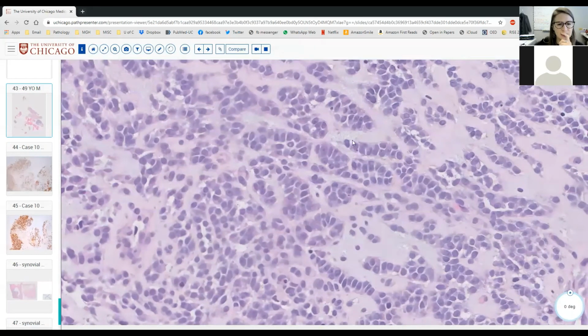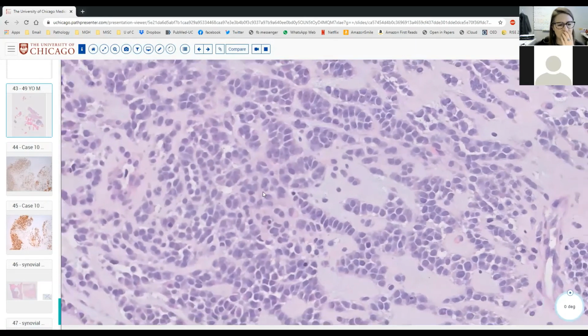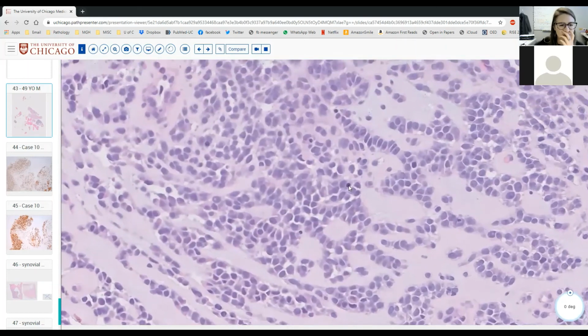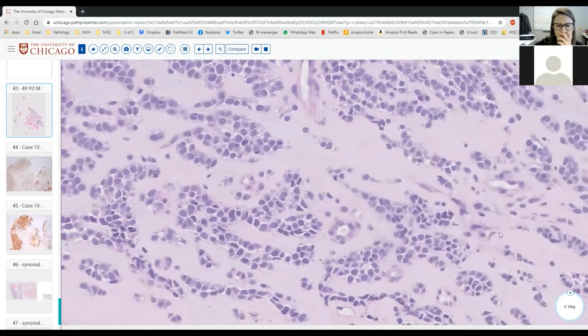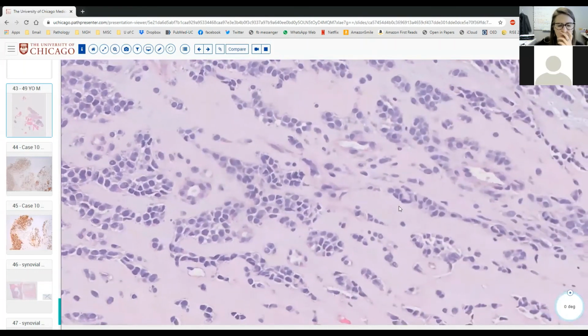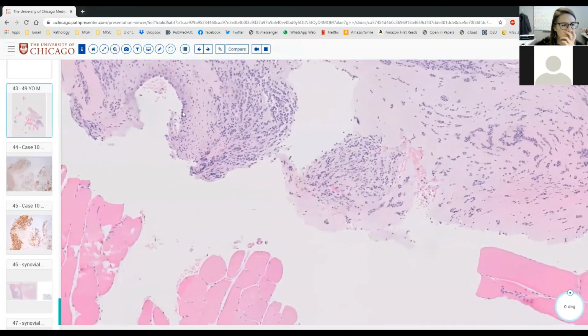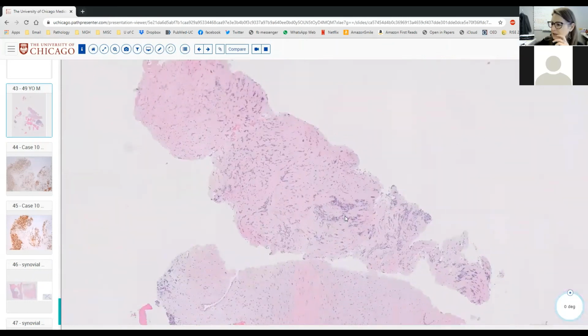Vascular lesion was brought up. You know, I don't see true vasoformative spaces, and I don't see red cells, so that makes vascular a little bit less on my differential. I do see some hyperchromatic cells and mitoses. I see some background stromal material. I think this is a little bit of a hard one.